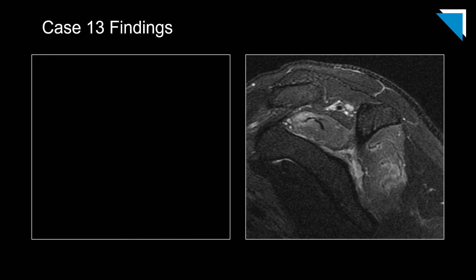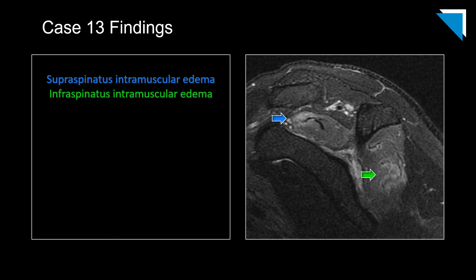We'll use an image from that sequence for a closer look at our findings. There is prominent edema in the supraspinatus muscle belly and similar findings in the infraspinatus muscle belly. Intramuscular edema in and of itself is a nonspecific finding.